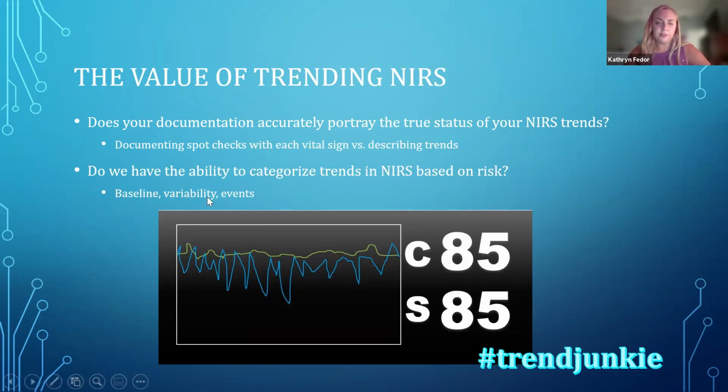As you can see in this picture, this is a visual reminder that even though this baby might be reading 85 and 85 at two separate hourly intervals, what both of these lines are doing is very different. So we continue to impress upon our team that while yes, it's important that we document absolute values on the hour, or whatever our protocol is for that certain population, we really pay attention to what our trends are trying to tell us.